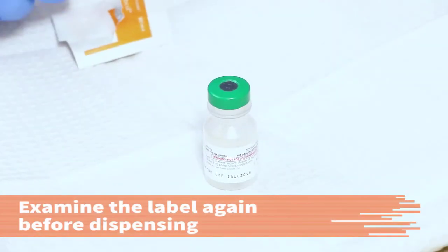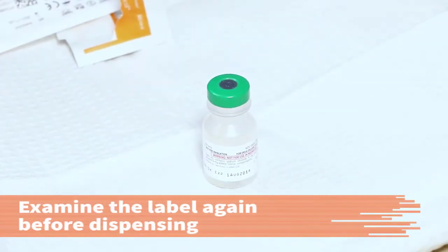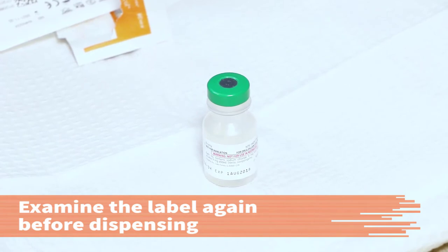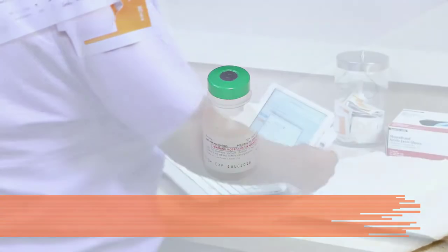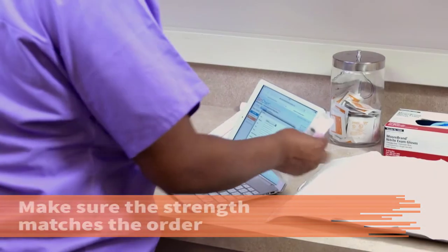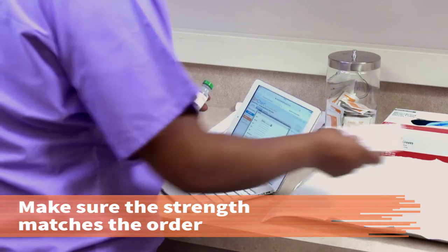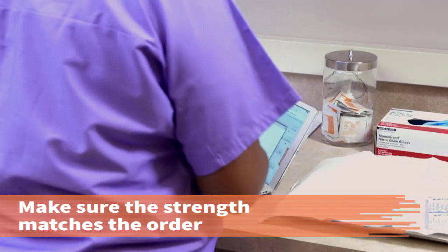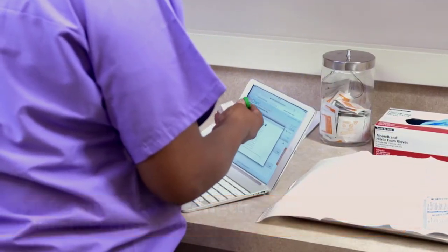Examine the label on the vial of medicine again just before dispensing the ordered dose. Make sure the strength on the label matches the order, or that you dispense the correctly calculated dose.